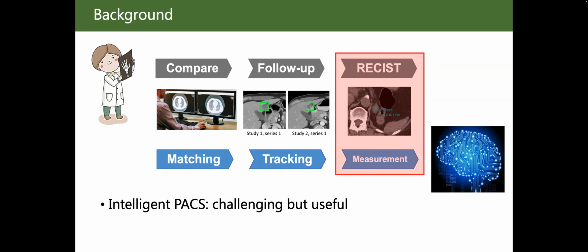In the last 3 years, our team focused on solving this problem by developing different tools for different tasks, such as point matching, which is used to do the comparison by radiologists, and lesion tracking. We try to develop some tracking methods to find the lesion at different time points. So we can consider this as trying to help doctors do their follow-up study.